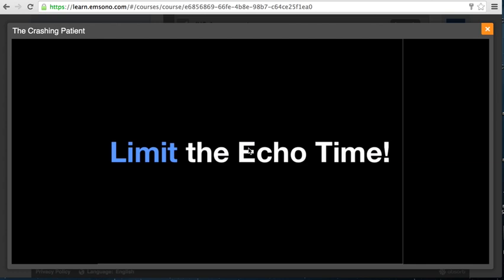What you don't want to do is have CPR stopped and then take 30 to 60 seconds performing an echo. This is not what you want to do. Just perform these exams very quickly. If you want to record a video at the time you're doing it so that you can review that once CPR is started, that would also be fine, but really limit the time that you're spending in performing these echoes.